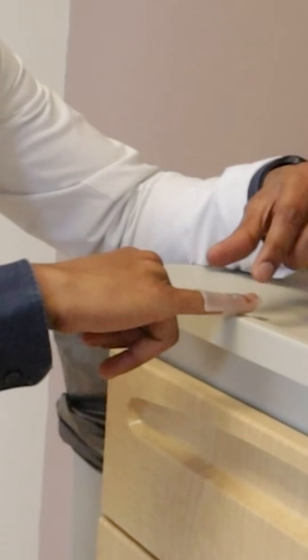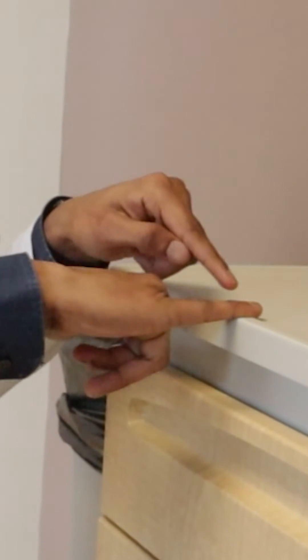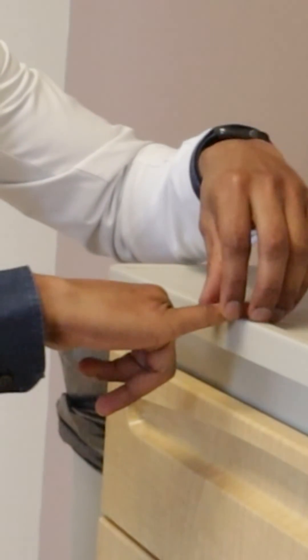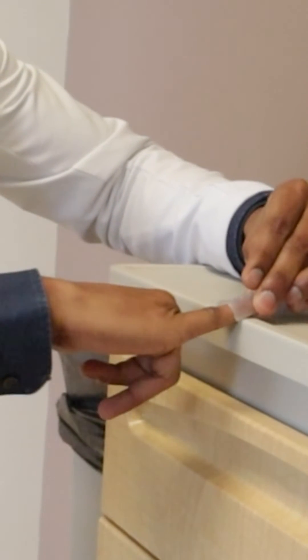Let's say you decide the splint smells stinky and you want to change it. You have to make sure your finger never bends in that process. The way I would do it is go to a table, keep my finger flat on the table so it doesn't go into bending forward. Then take soap and water, clean the finger, and with the help of someone, put the splint back so that the finger never goes into flexion or bends forward.